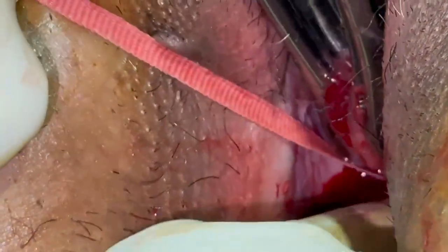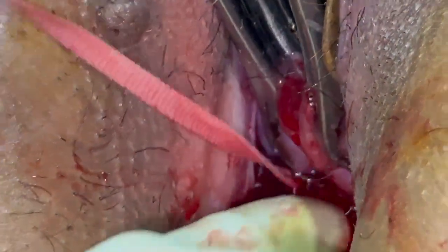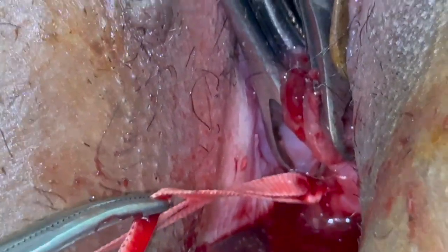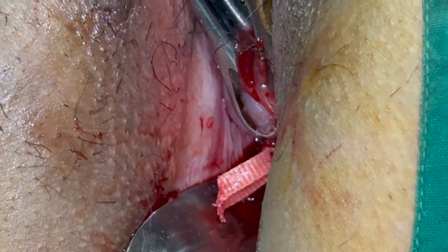So I think we have taken one more stitch on the knot so that the knot should not slip with the Mersilene.